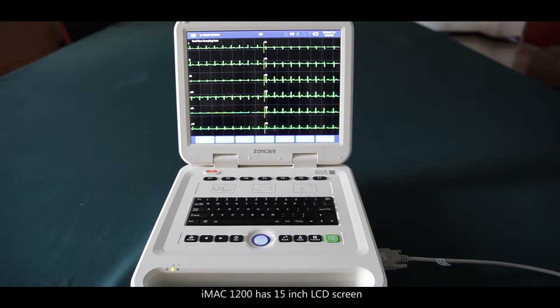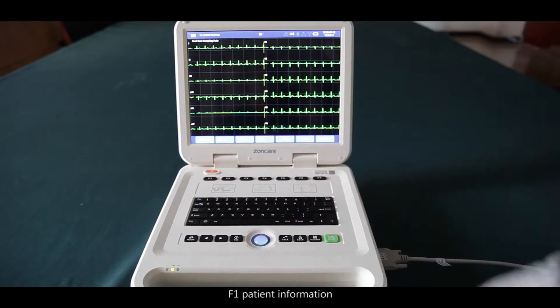The iMac 1200 has a 15-inch LCD screen. F1 to F7 are the shortcut keys. F1 is the patient information key.